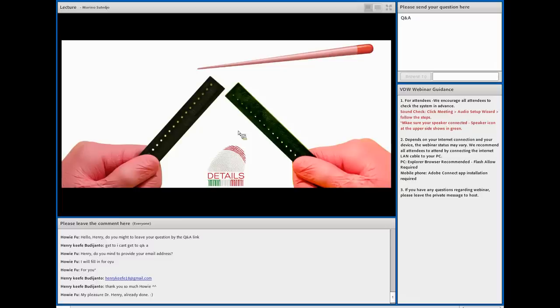I suggest you don't take 25/06 gutta percha if you want to do the warm vertical obturation technique. If you want to use single cone, that is another story. But if you are talking about three-dimensional obturation to fill all the spaces, it means single cone is not advisable for this kind of obturation technique. But if you want to use warm vertical condensation in this case, we need to plasticize our gutta percha and we want to condense and pack it as a homogeneous material. Definitely, I suggest you take taper 4 of gutta percha. Because sometimes if you use taper 6 with the same taper, the fit is not in the apical area, but in the body of the gutta percha.